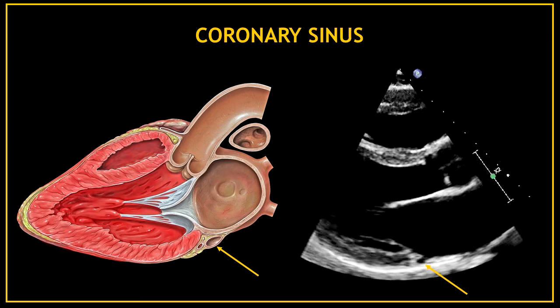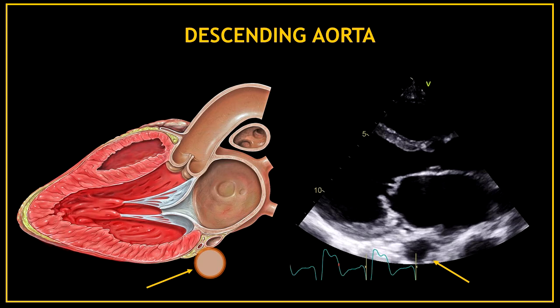Sometimes after the posterior mitral valve annulus and before the pericardium we can see a small and rounded black circle or echo-free space — this echo-free space corresponds to the coronary sinus. After the pericardium, sometimes you might see a bigger rounded echo-free space; this space corresponds to the descending aorta.